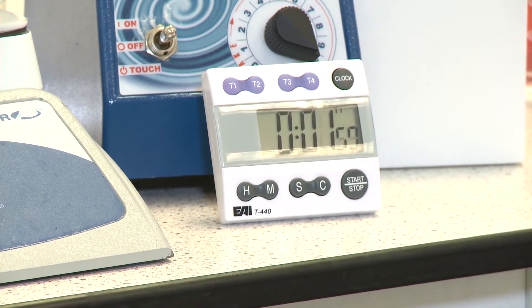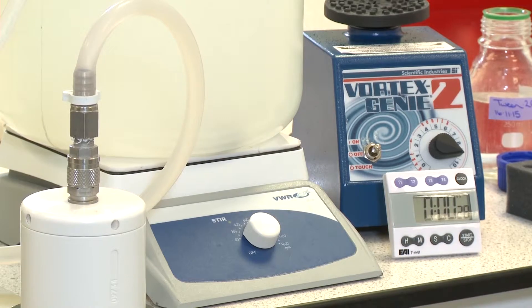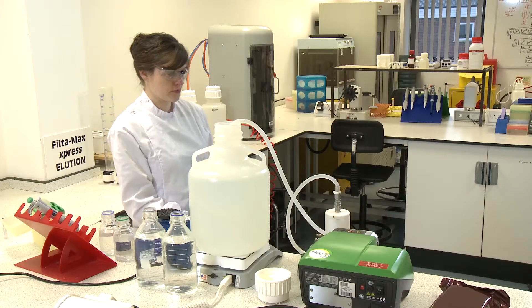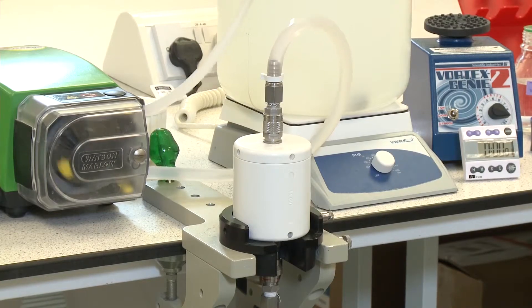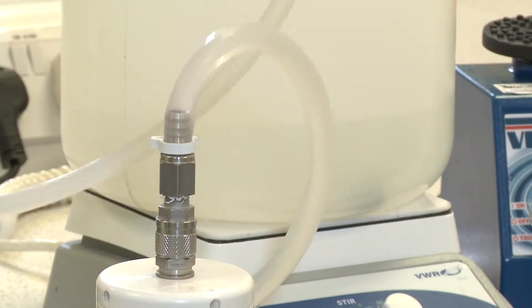Ensure that the sample is stirred for at least one minute prior to filtration. Start the pump and ensure all of the sample is filtered. Some air may pass through the filter but try to minimise this.